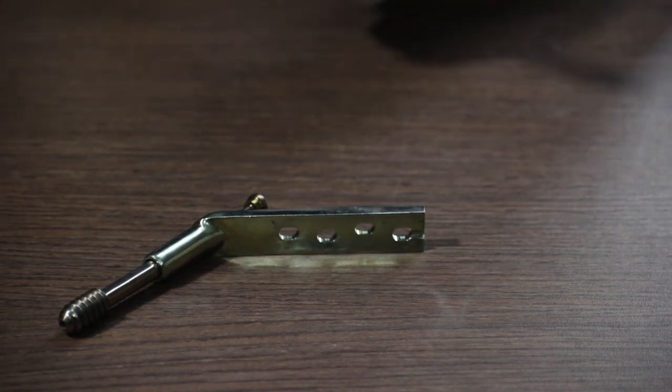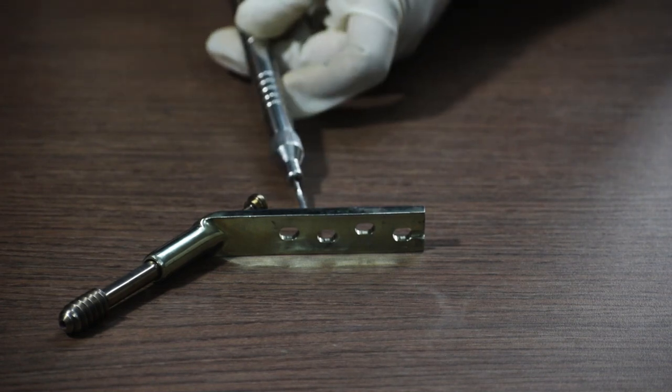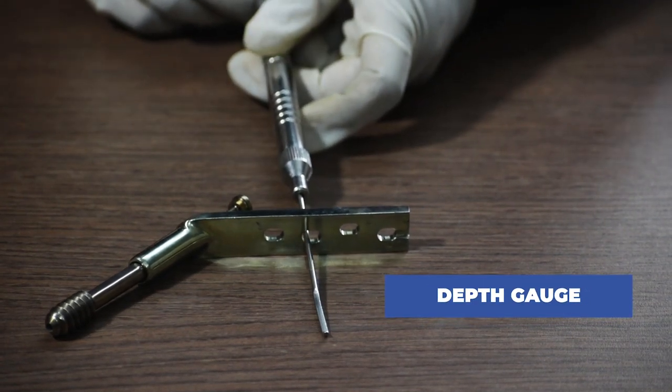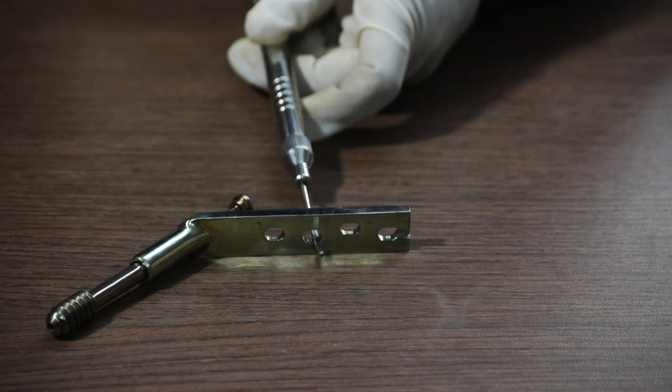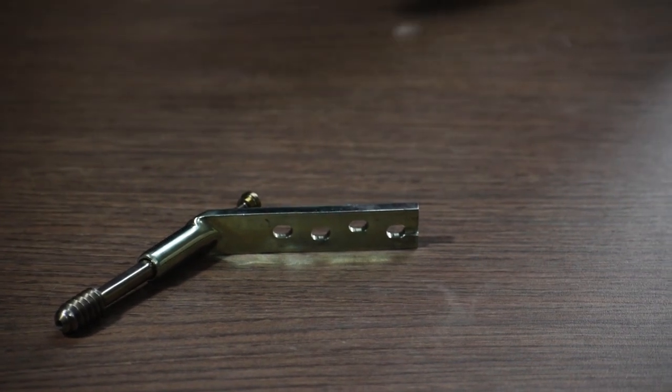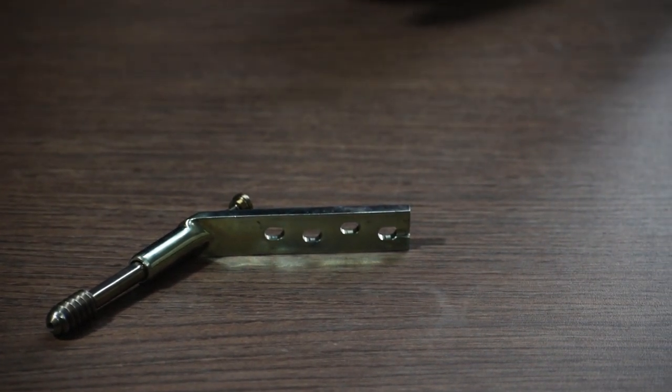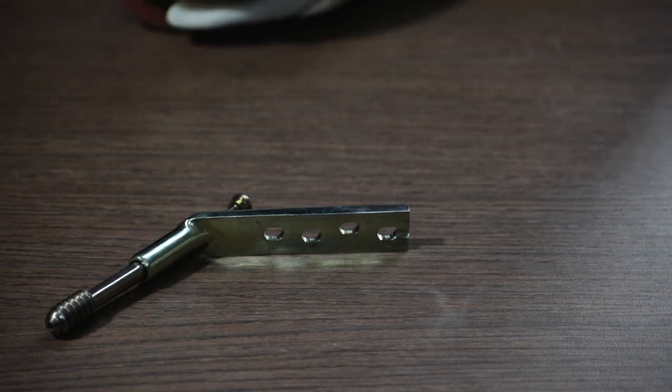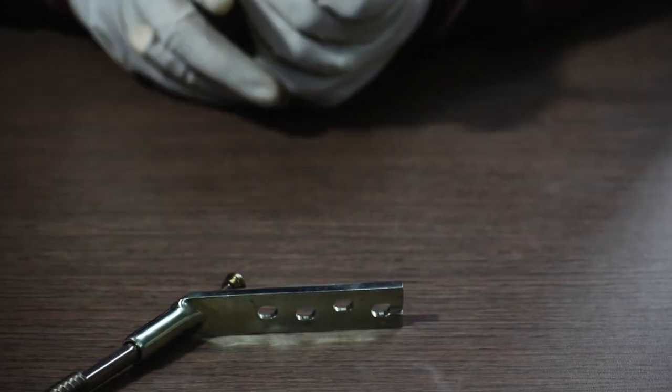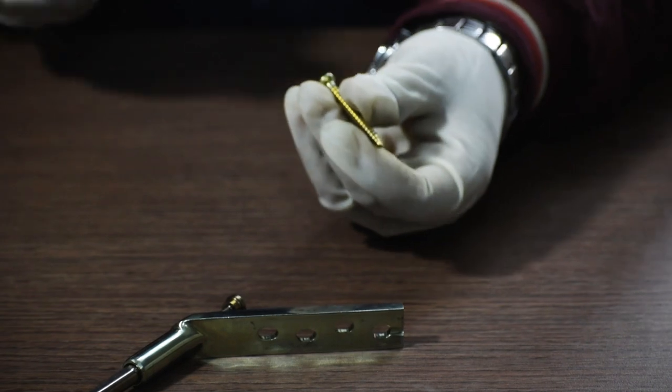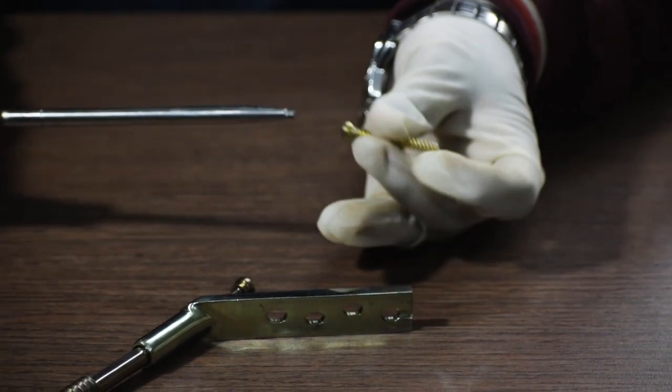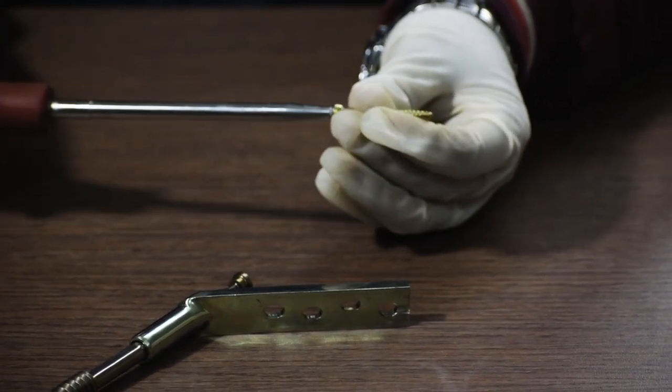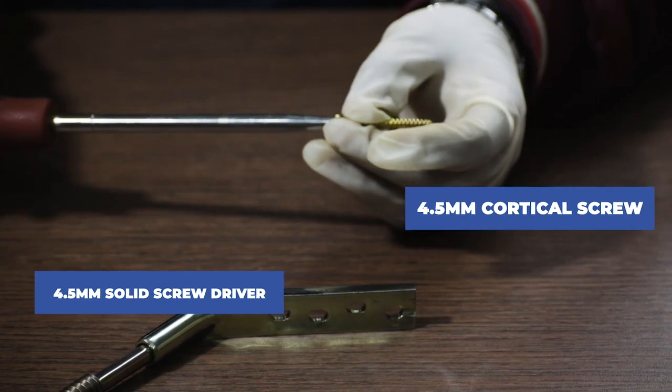After that we will use a depth gauge to measure the length of the screws to measure the length of the bolts needed to be fixed in this hole. After that we take the screw of the length required and with the help of a 4.5 mm solid screwdriver we are going to fix a 4.5 mm cortical screw through the drilled hole in the shaft region of the plate.